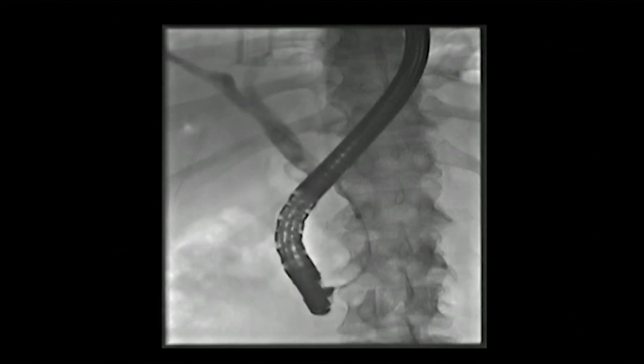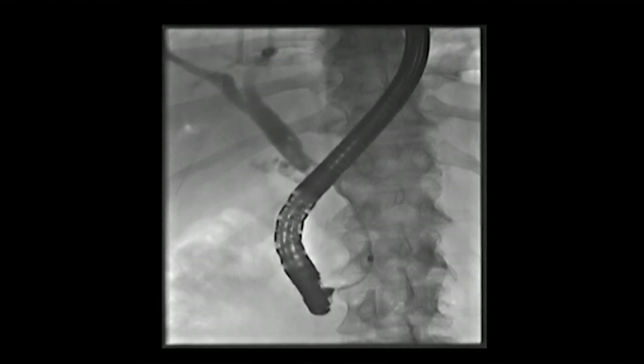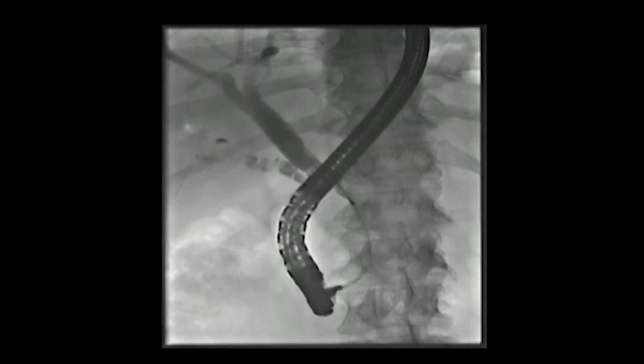There's not much dilation, but of course that was because there already was a plastic stent, and you see the distal stricture there. There's some debris above the stent. You see some filling of the cystic duct.